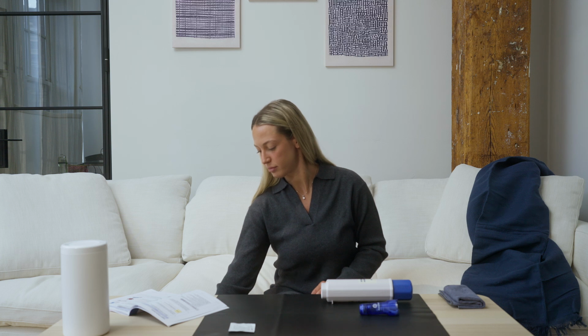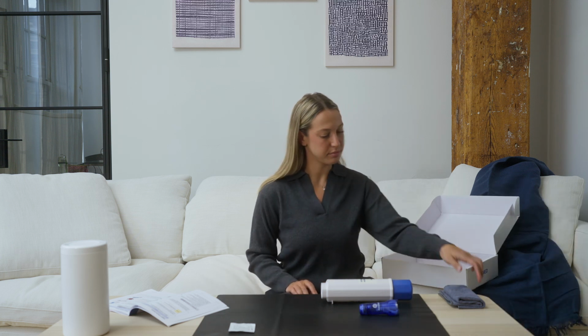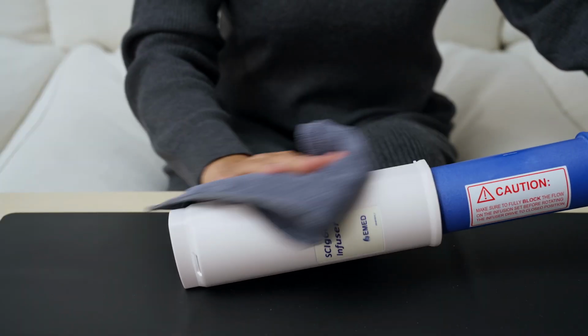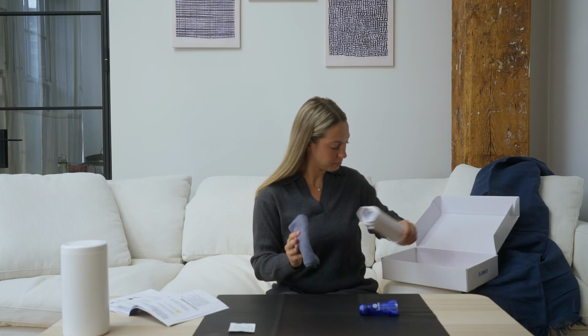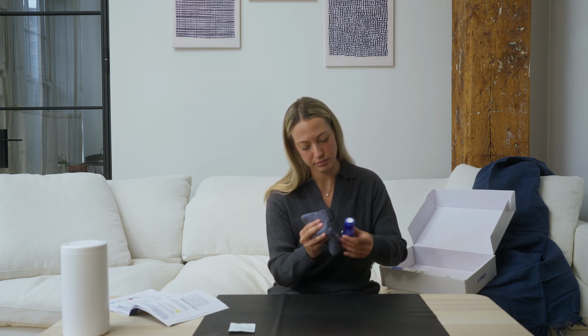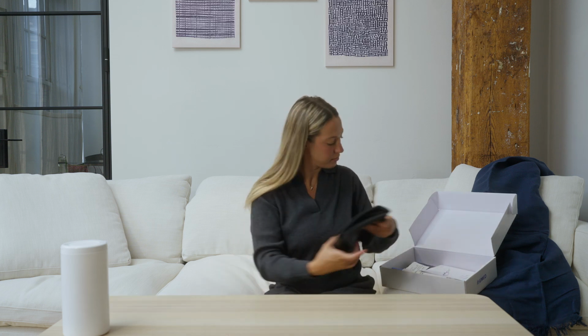Clean and store your pump in a safe, dry place or in its carrying case for next use. To clean your pump, you may use 70% isopropyl alcohol wipes or a soft cloth dampened with a weak solution of mild detergent and warm water, approximately 1 part detergent to 50 parts water. Do not at any time attempt to disassemble or clean any part of the pump that is not easily accessible.